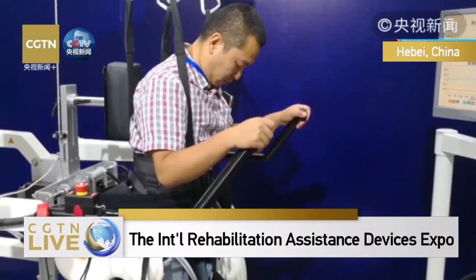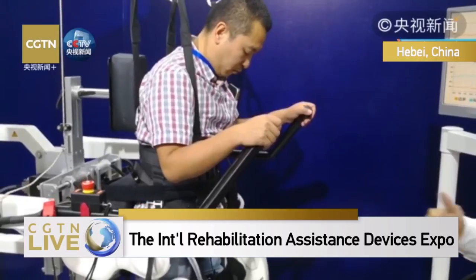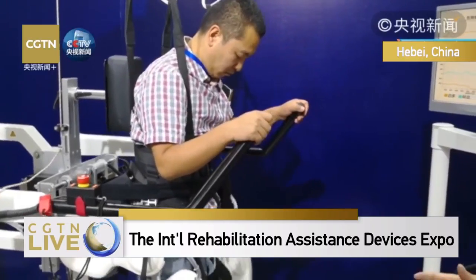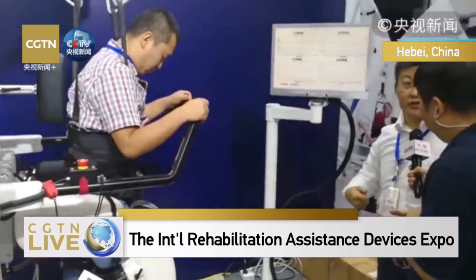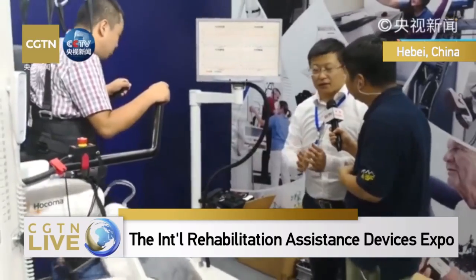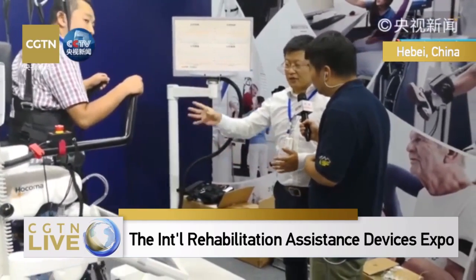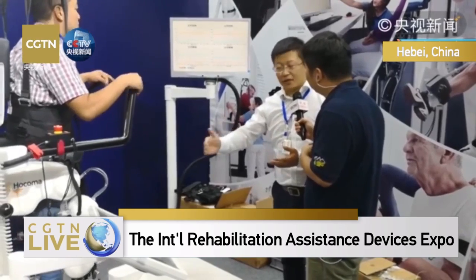So this will help the patient, especially those at the early stage, to be part of the exercises as soon as they can. Because in the early stage, the traditional way would be that the therapist must help the patient to exercise on a daily basis.